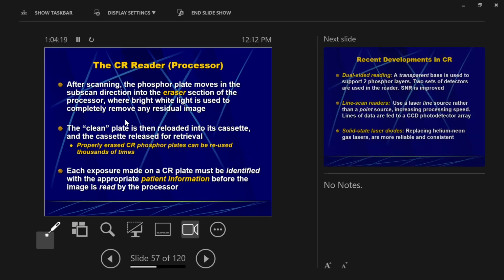Okay, let's talk about a couple important things. The phosphor plate can store X-ray energy and release it later on, minutes later usually, or seconds later, right? Because you just grab it and go to the processor. It releases that energy later as visible light. The computer can read that visible light and build up an image based on that, okay?